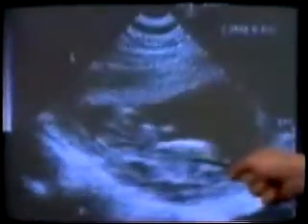We now see the heart beating here in the child's chest. The heart is beating at a rate of approximately 140 a minute. And we can see the child moving rather serenely in the uterus. One can see it shifting position from time to time. It is still orientated in this manner. And the mouth is receiving the thumb of the child. The child again is moving quietly in its sanctuary.